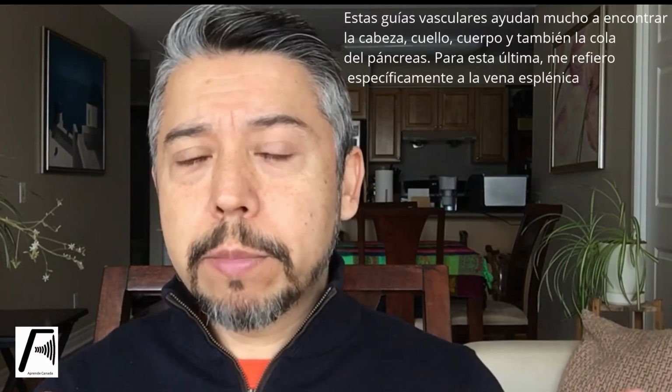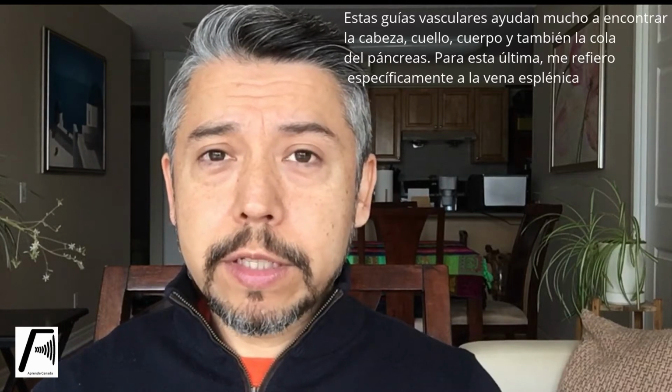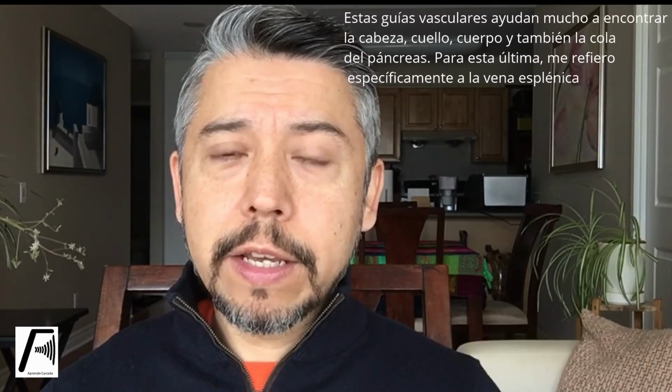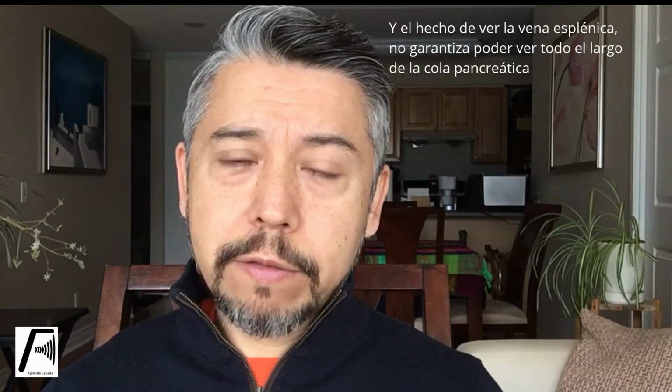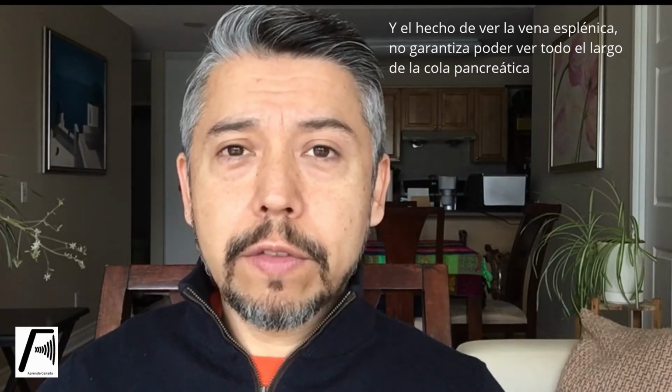But those landmarks help us a lot for the head, the neck, and the body, and of course sometimes for the tail, and I'm talking about the splenic vein. But in some patients, the tail end is not well visible from the anterior window, and so even though we see the splenic vein, we may not see the entire extension of the tail.